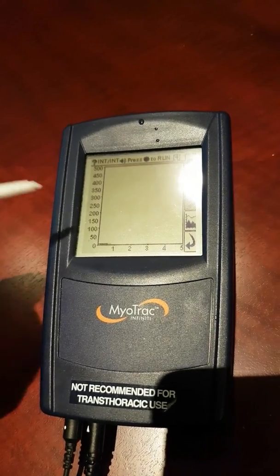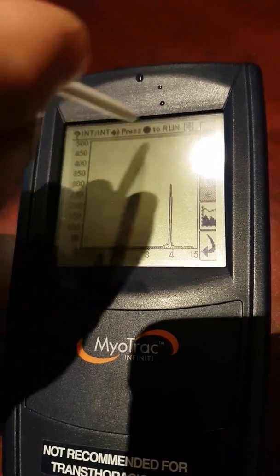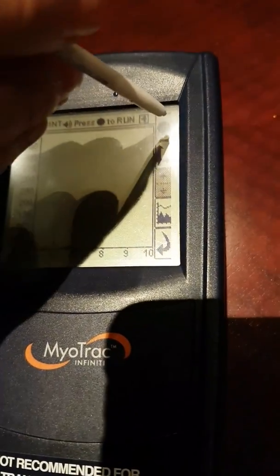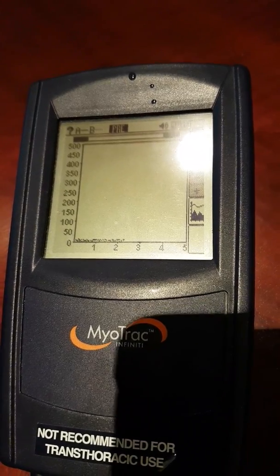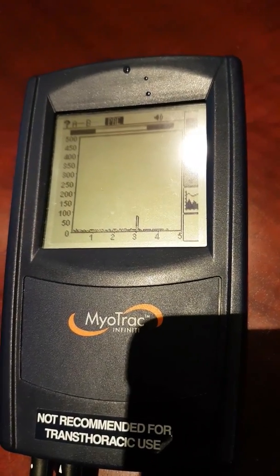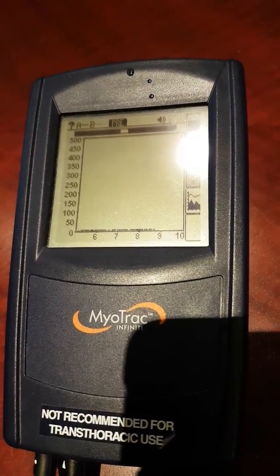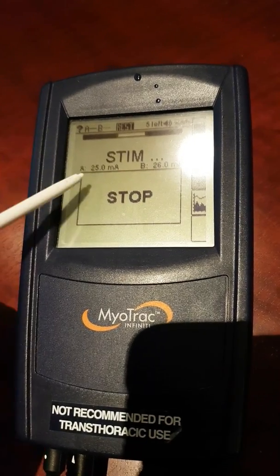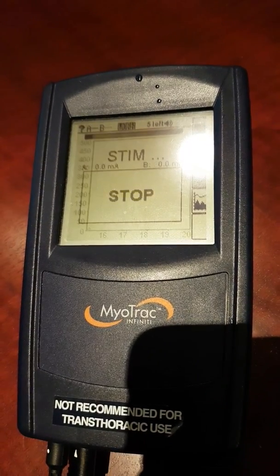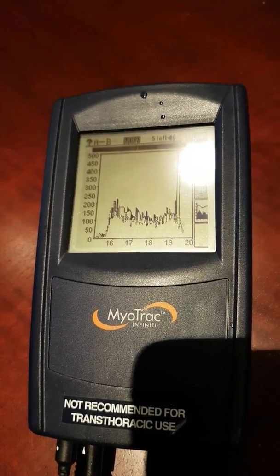The session loads. We have some signals, but we're not yet recording data until we press that circle. So once we do, we're going to go through that pre-baseline in the training phase. So we're just measuring baseline muscle tone. Rest. We're going to rest, so the Stim's going to kick on to that intensity that we set on each side. Work. Then we'll work. Rest. And relax.